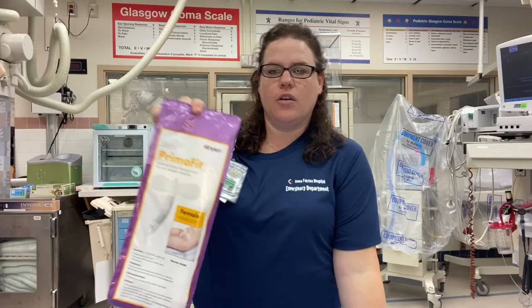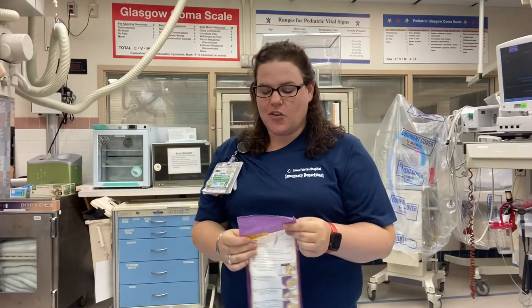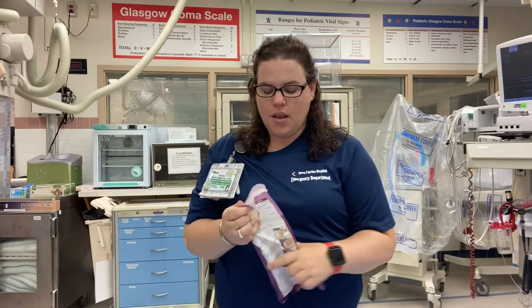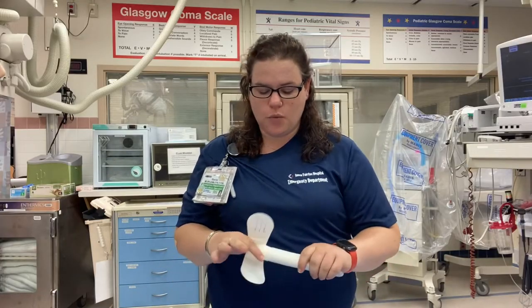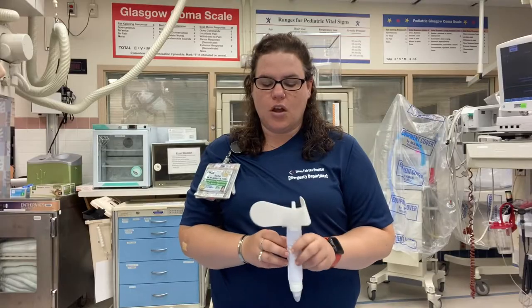We're going to talk about the external male and female catheter options that we have in the department. The first one we're going to talk about is the external female catheter called the PrimaFit, also called the She-We. When you explain it to your patients, you can tell them that nothing's inserted, it's low risk for infection, and just about any patient can be placed on it.